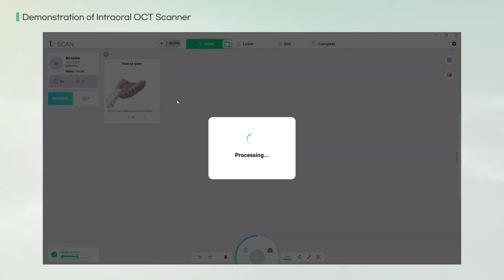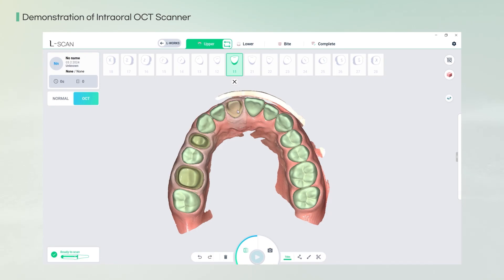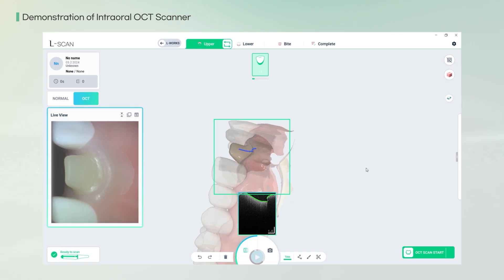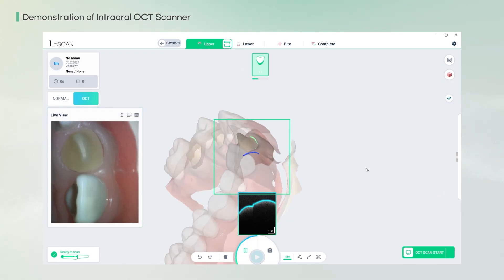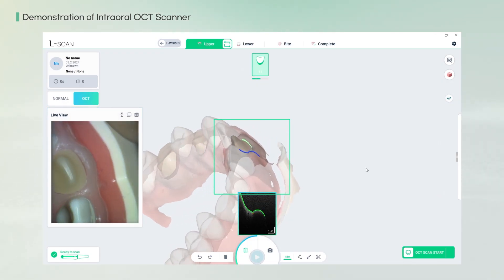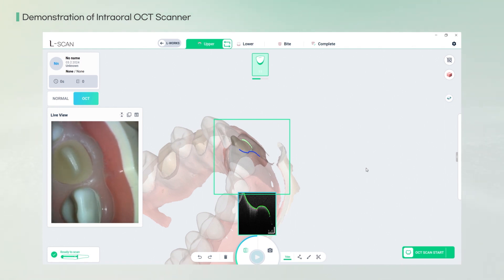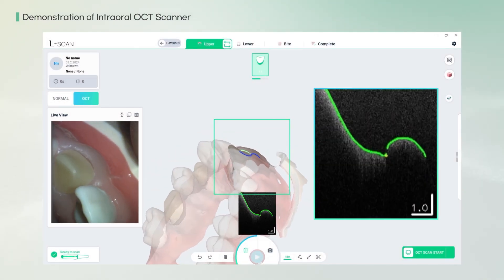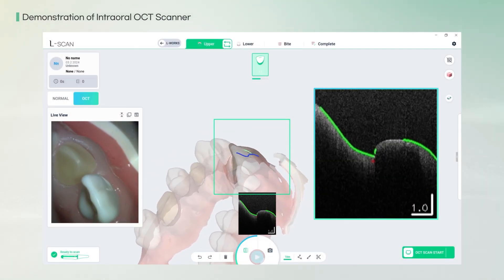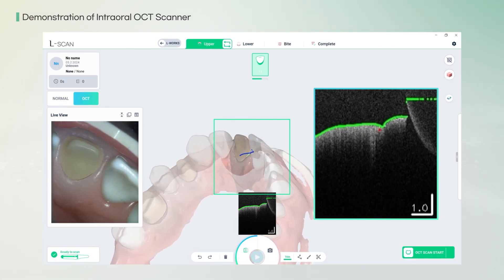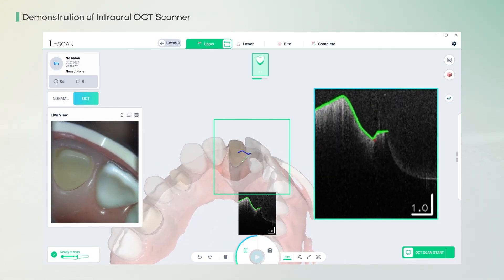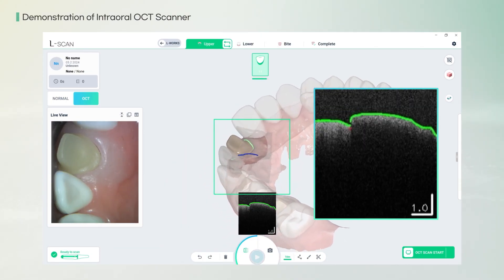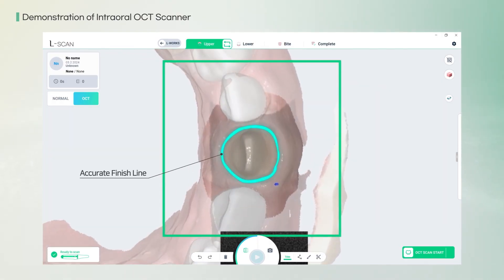OCT scan — the world's first oral scanner to integrate optical coherence tomography functionality — emerges from over two decades of distinguished expertise in optical technology. It enables rapid digital impression acquisition with an expanded and deeper scanning area, and OCT technology leveraging high-wavelength light allows real-time understanding of oral structures for more accurate diagnoses. Experience the undeniable difference with OCT scan's optical interferometry imaging capability, which offers advanced precision like never before.